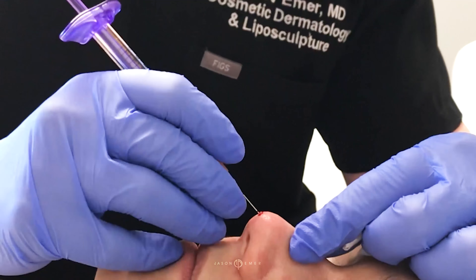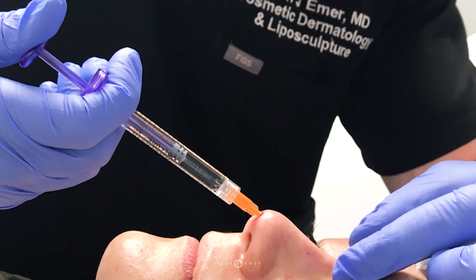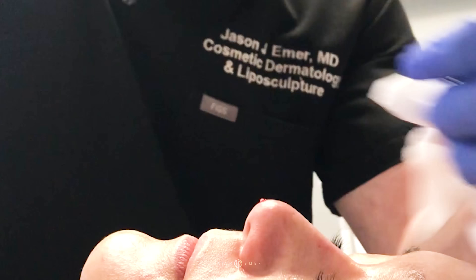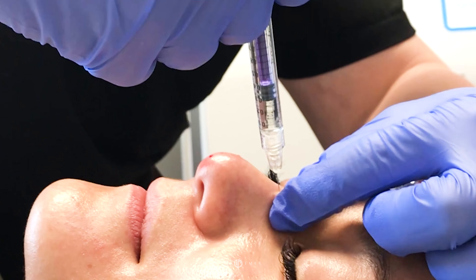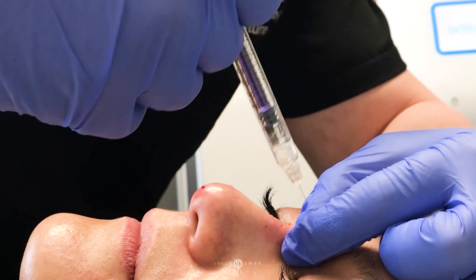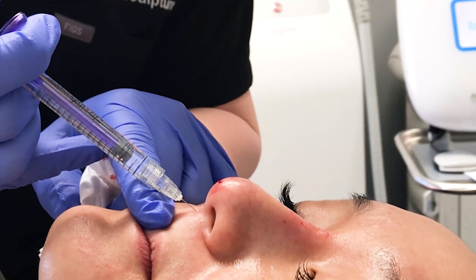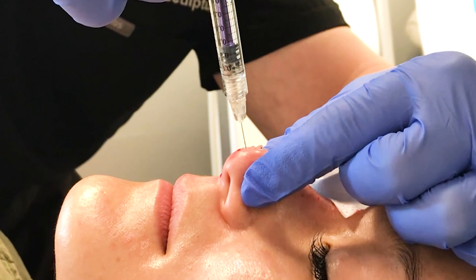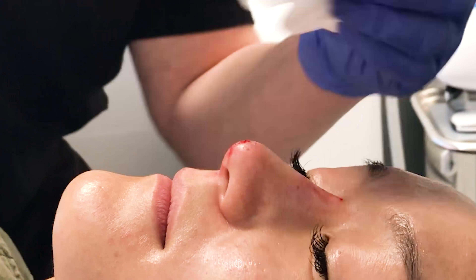Going into the cartilages here to make it a little straighter. This will give her a nice illusion of a very straight bridge, and now the nasal tip being a little elevated.